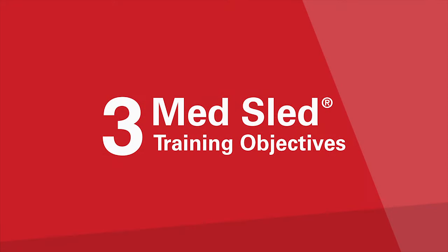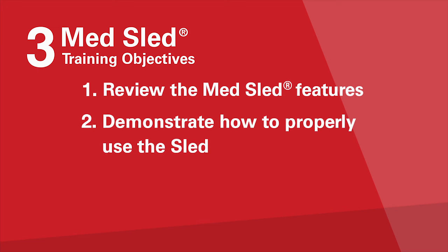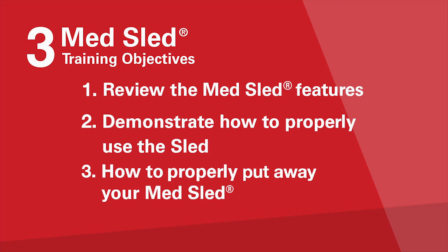The objective of this training video is threefold. The first objective is to provide an overview of the evacuation sled so staff can have a basic understanding of the sled features. Secondly, we will demonstrate the use of the evacuation sled. And lastly, we will demonstrate how to properly put the sled away in what we call an evacuation-ready state.